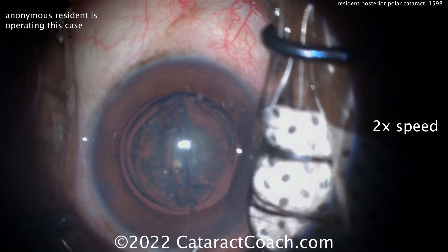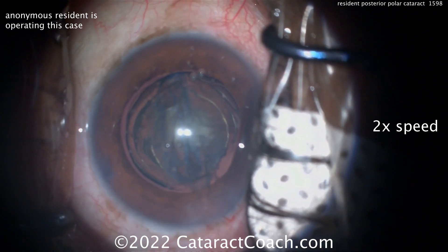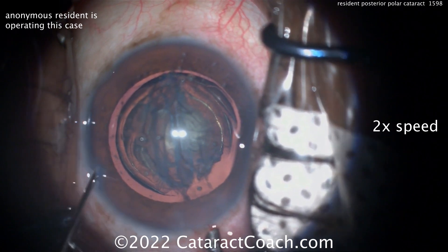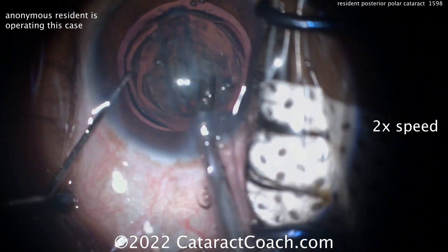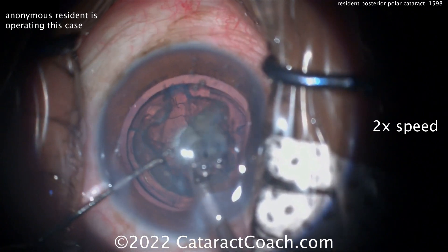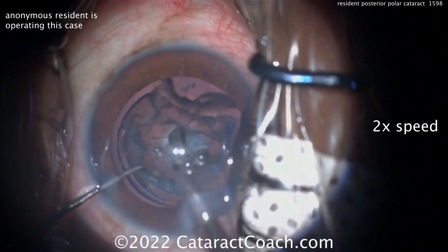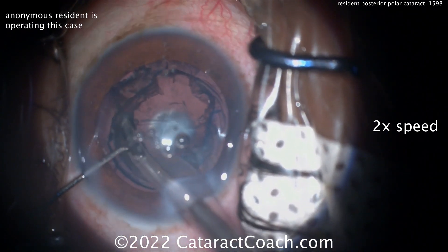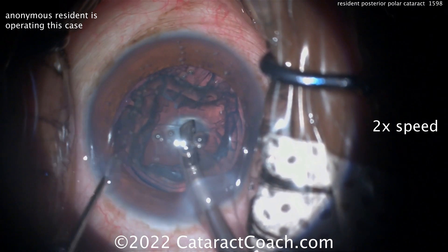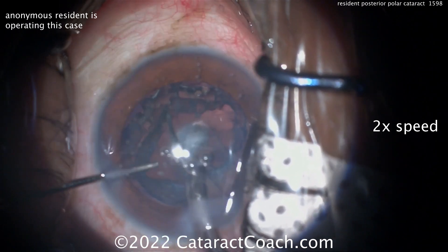I like to do a visco-dissection technique to get out that epinuclear shell as well as lens cortex. A little more viscoelastic now in the anterior chamber, and probably going in with the phaco probe again, trying to get these pieces out — vacuuming those up. Really not a lot of ultrasonic energy needed here; these are pretty soft. That endonucleus comes out, and you can see there's the epinuclear shell. If you can get the whole shell out of the bag like this, that works fine.